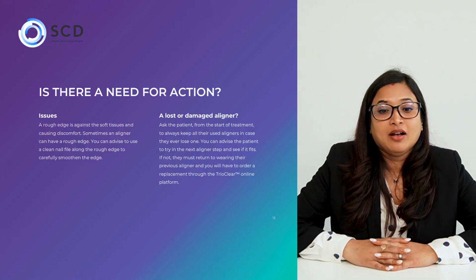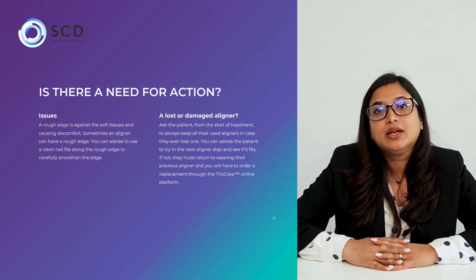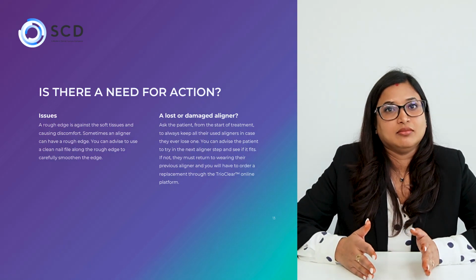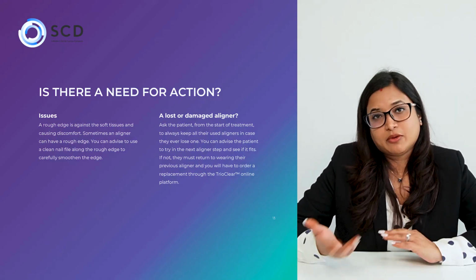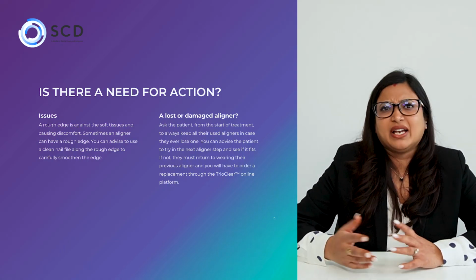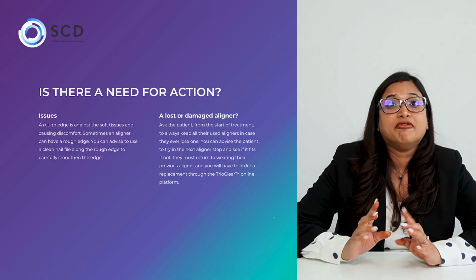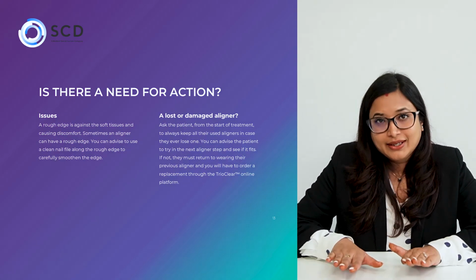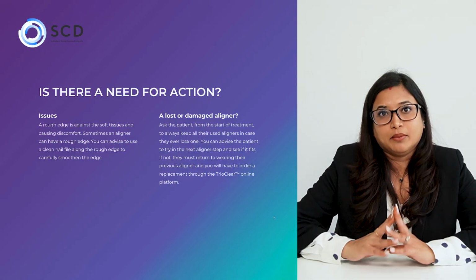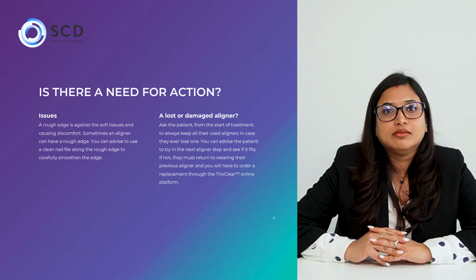So yeah. Another thing is, if the patient has lost or damaged an aligner, it's very important to be transparent with your patient. The patient shouldn't be scared to tell you that, okay, probably I have lost one or some of my aligners. They should be able to tell you all of that. Or if they have damage because of any reason, then we have to ask the patient from the start of the treatment, very importantly, to keep all their aligners. This is a protocol which I think most of the aligner companies follow, and we have to highlight this again. But sometimes the patient might not take note of it.